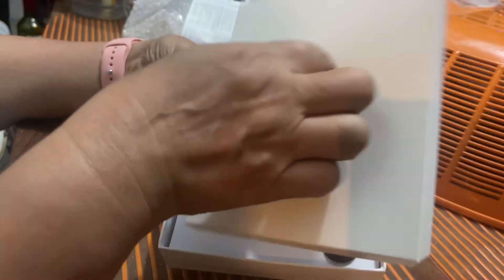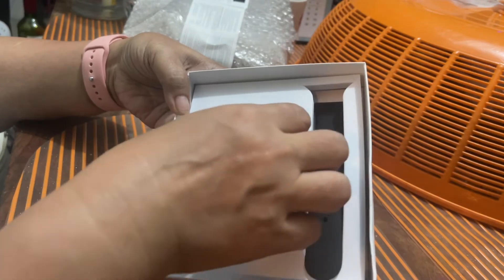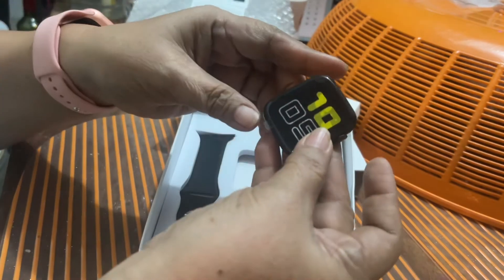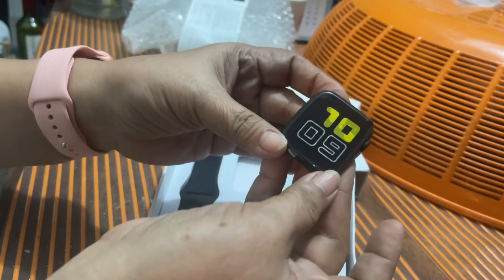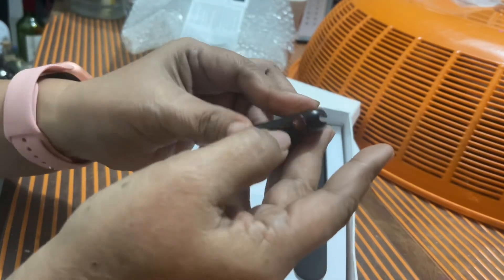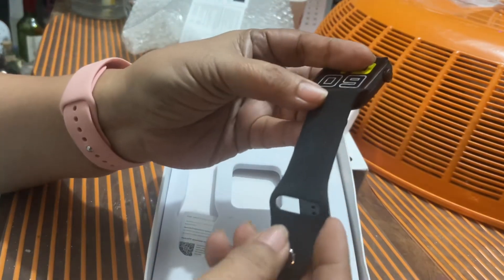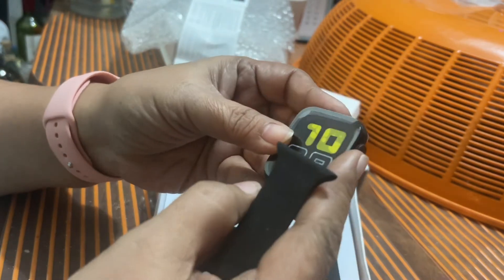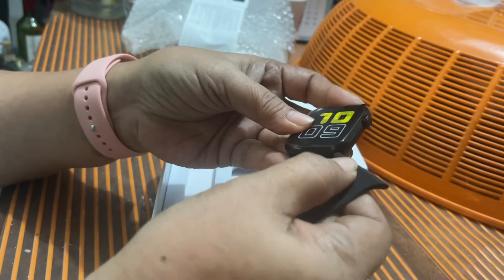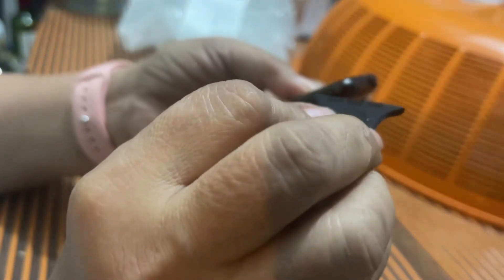Ito na ulit — yung isa, yung sa husband ko. Kasi binalik ko siya, so ilalabas ko ulit at ito naman ngayon ang titignan ko at aayusin. Sa totoo lang, pwede daw itong i-connect sa aking cell phone. Pero ang talagang main objective ko in buying the watch is just to monitor my blood pressure.